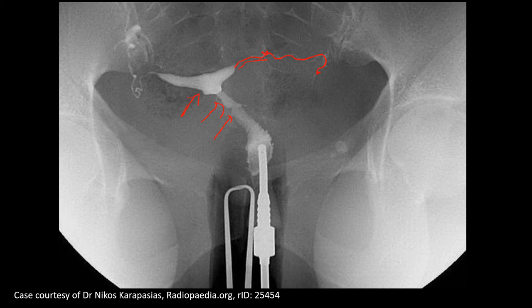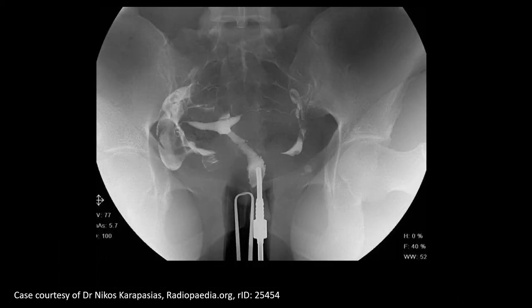Similarly, you can see the same appearance on the other side as well. When we inject further dye, the dye spills out from the fallopian tube. This indicates that the uterine cavity is patent as well as the fallopian tube is patent. Here, the dye has spilled out into the peritoneal cavity.